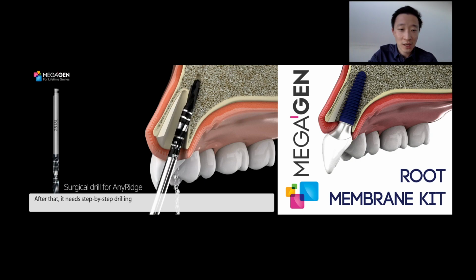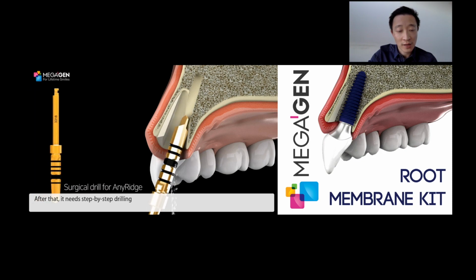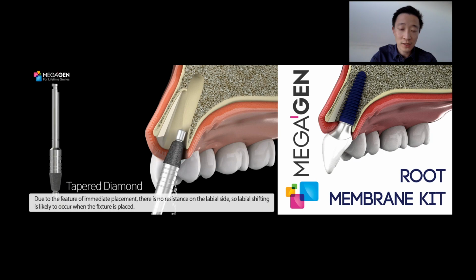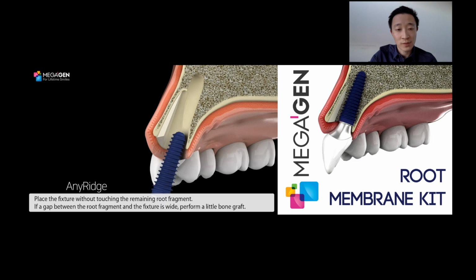Here you see the sequence of drills for any ridge implant placement, making sure you're going to depth and keeping that angulation and direction constant. So as you finish the last surgical drill for any ridge, before placing the implant, you want to use this tapered diamond drill to just reduce the palatal portion of that alveolus a bit, so that when you place the implant, it does not get pushed towards the buccal and onto the shield.